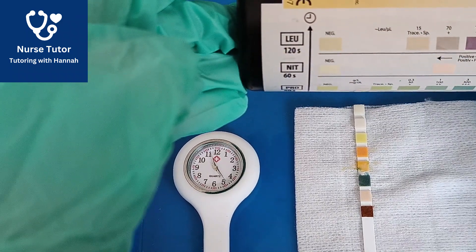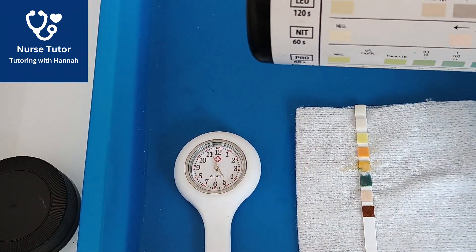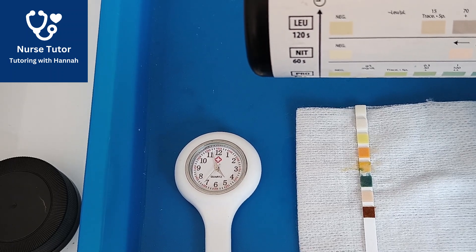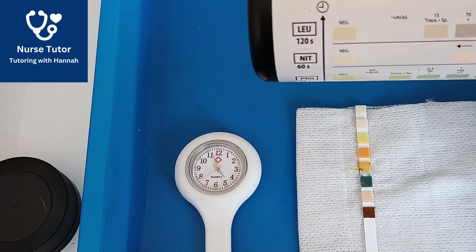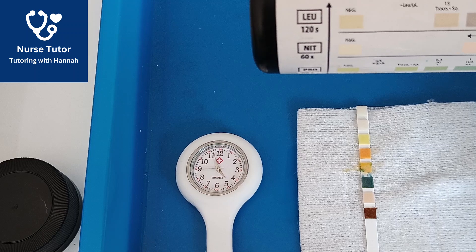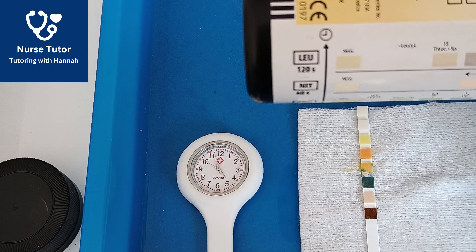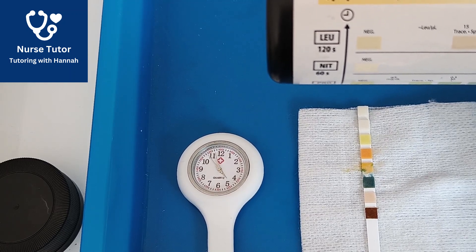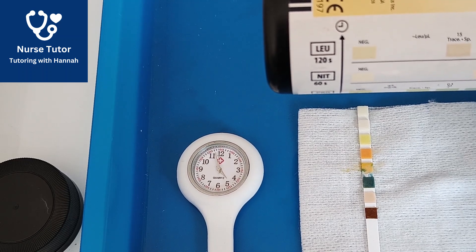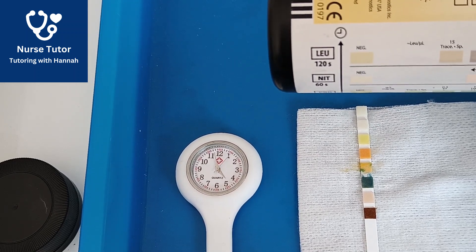Now we're going to wait for the full 120 seconds from since we dipped it — the second hand needs to go all the way up to 12 o'clock. This can feel like an eternity in your NMC OSCE exam, but it's really important you don't read this before the timings — otherwise it's an automatic critical fail. My 120 seconds has passed now, and I can confirm that the leukocytes are negative.